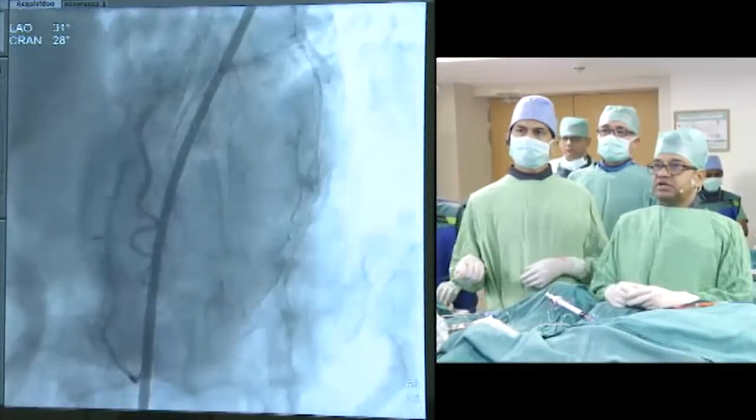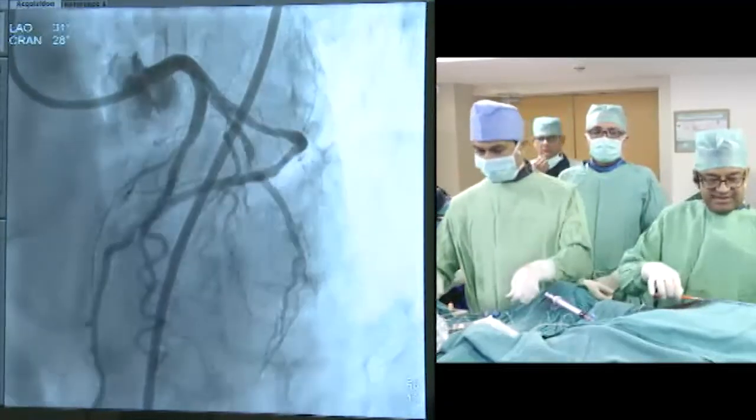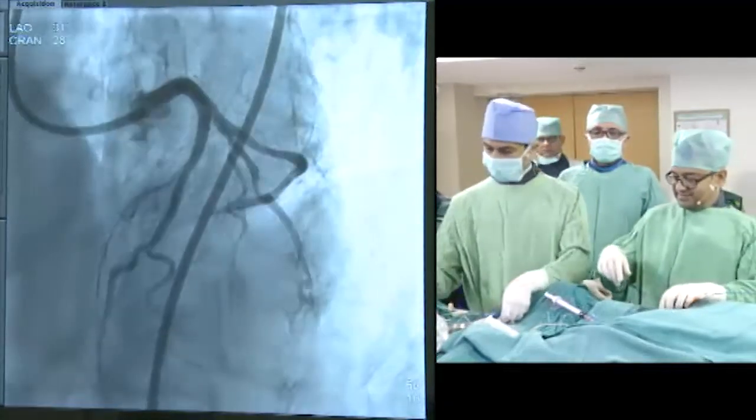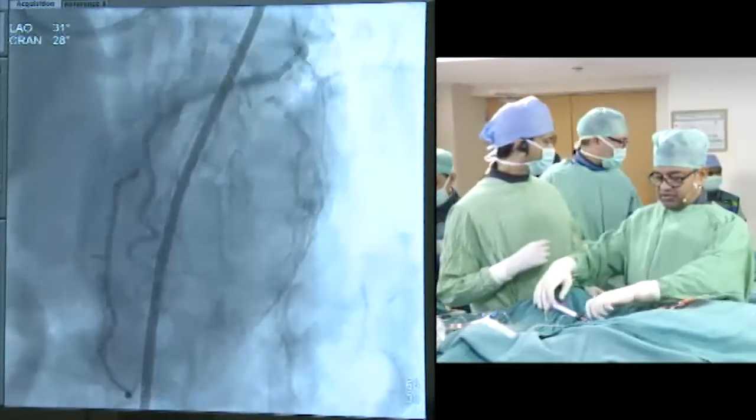That's also fine. So we'll take leave, we'll do a Perclose to this lady because she's tired. Thank you and congratulations to your team, Dr. Kumar. Can we have the wire, please?